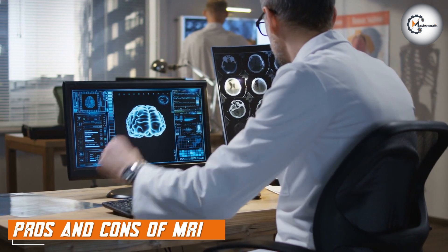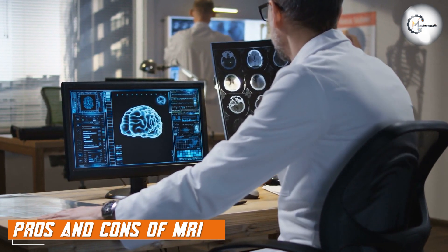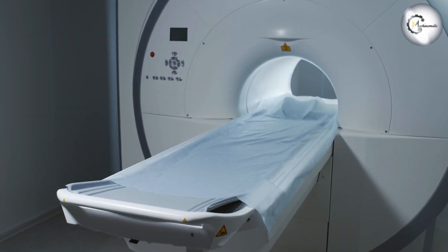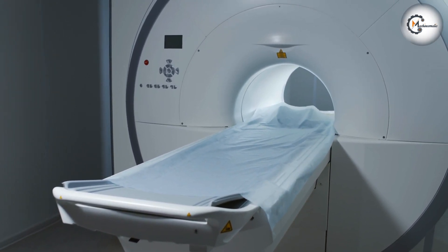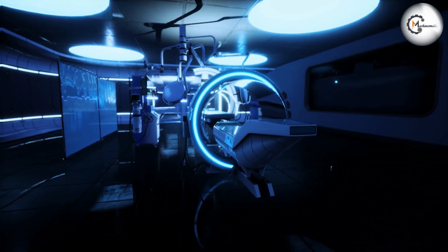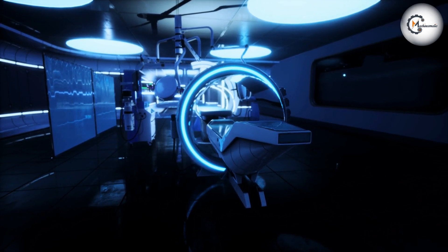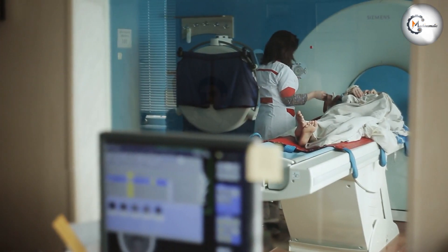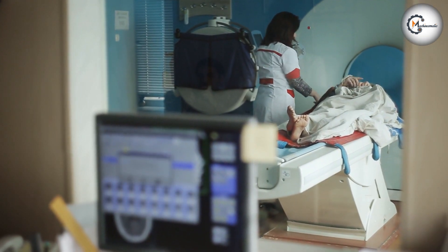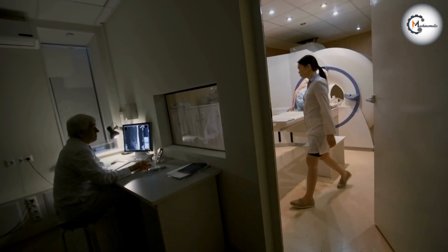MRI also has several pros and cons. One of the biggest advantages is its ability to produce detailed images of internal body structures, helping doctors diagnose bone-related conditions accurately. MRI is also a non-invasive procedure that does not use any radiation, so there is no risk of harmful side effects. However, one of the biggest disadvantages is that it is a relatively expensive procedure, and it can also take longer to perform than other imaging tests, which can be inconvenient for patients.